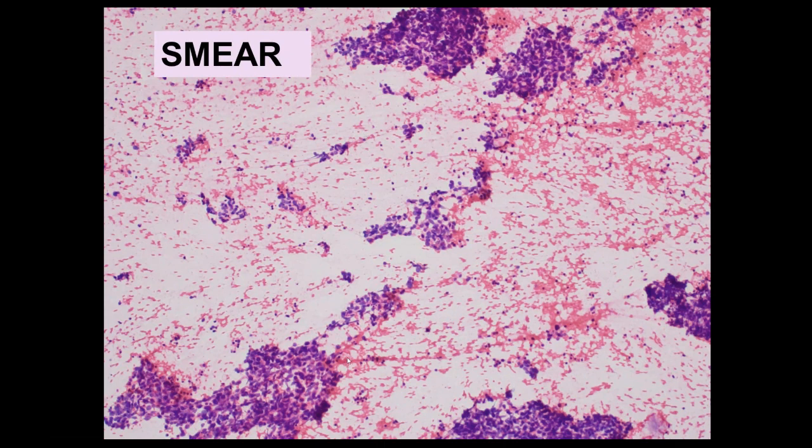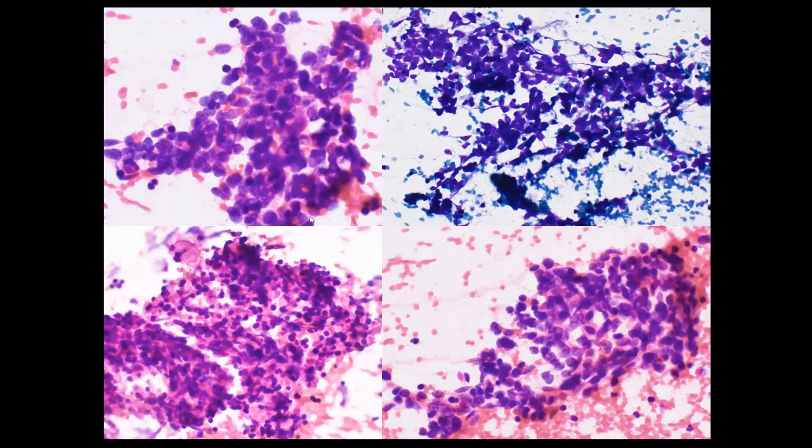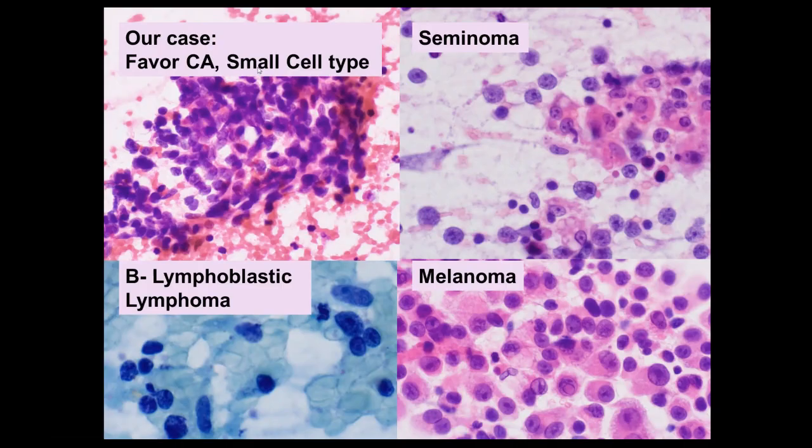You can see that you have tumor cells, most of them aggregating in clusters. And you look closer, you see that the cells have a high N/C ratio, hyperchromatic chromatin, there is necrosis. There is a hint of molding here and there. There is a lot of crush artifact and a lot of clustering. So we have this feeling that this is probably, we favor a carcinoma. And this type of chromatin is like the type of chromatin you can see with small cell. So if you compare with the other entities in the differential diagnosis, seminoma would have a lot more cytoplasm, vacuolated, prominent nucleoli.